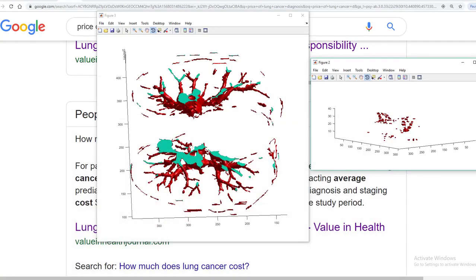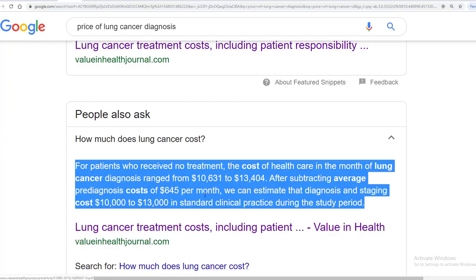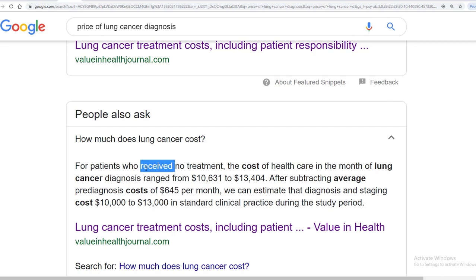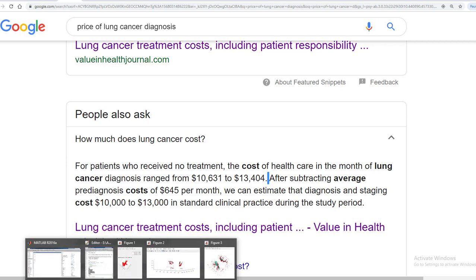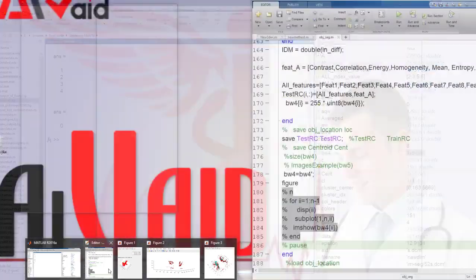So let's move toward the main. Hi guys, Ajay this side again and today I have brought another tutorial of health AI. That was my stats I was talking about - for patients who received no treatment, the cost of healthcare in the month of lung cancer diagnosis range around 10,000 to 13,000 USD. Here I will show you my output first and then move toward the main program and explain how to understand it.